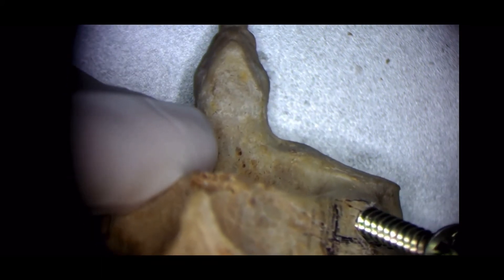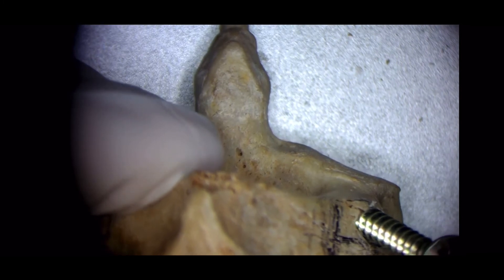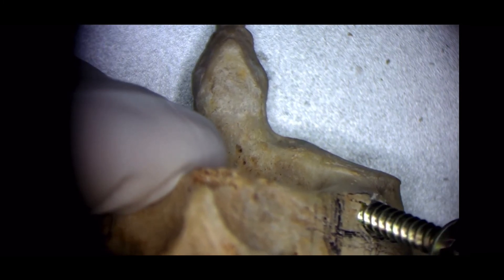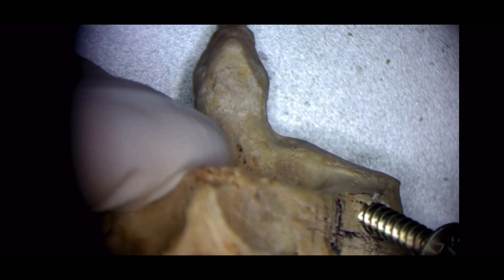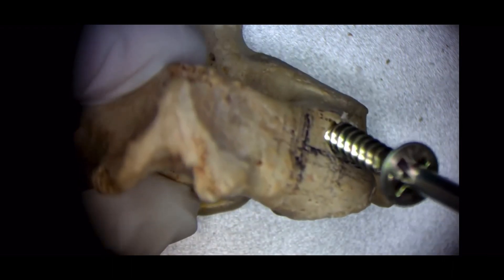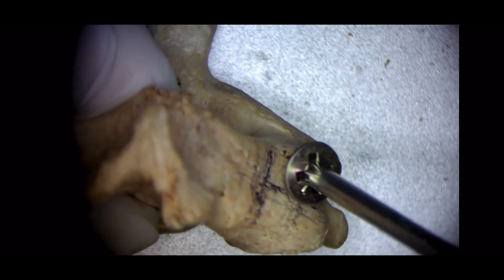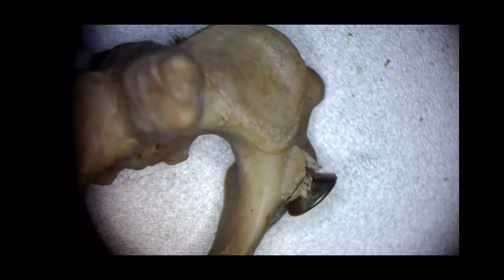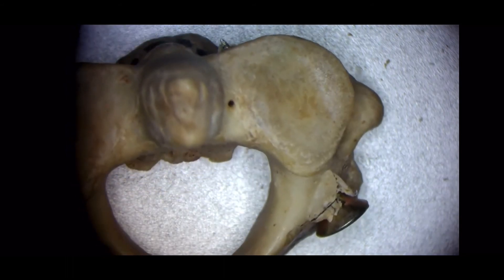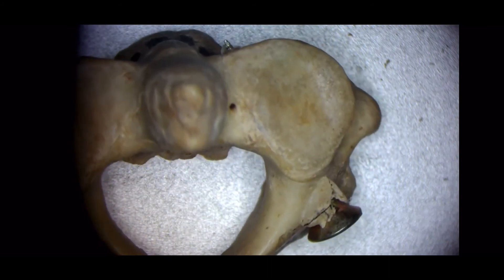I am purchasing the screw through the entry point. You can see the entry point is in the upper and inner quadrangle. From above, you can see the superior surface of the facet and also the anterior purchase of the screw through the anterior cortex.